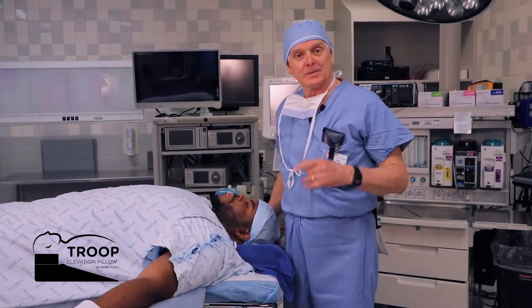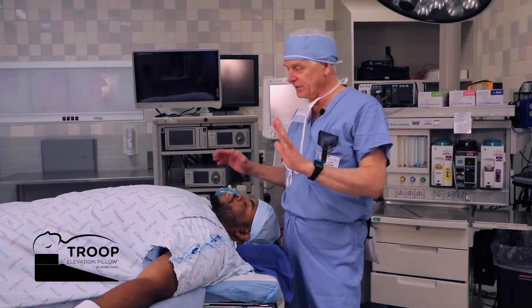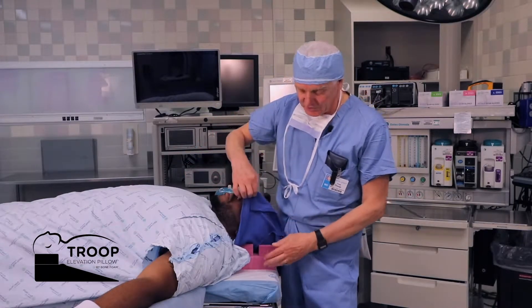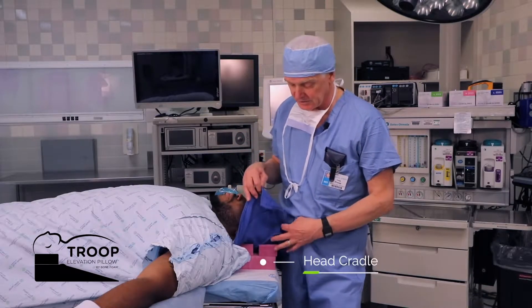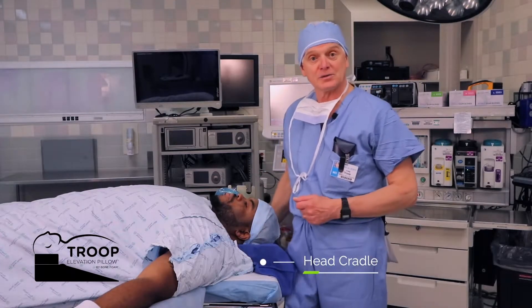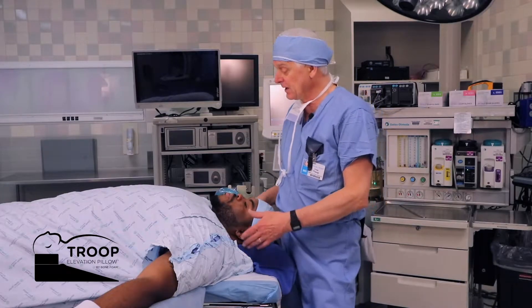This is our standard setup for most patients, with the patient fully supine and on a standard intubating pillow. This one's pink — they come in a lot of different colors and shapes. This is the standard setup with an average size person, perhaps even an average size like myself.